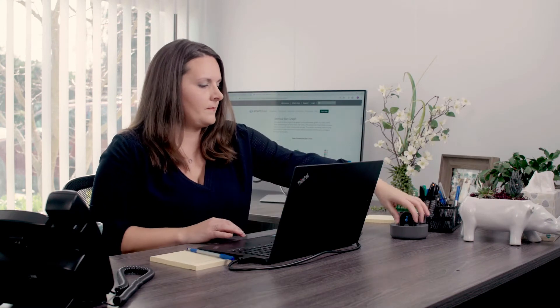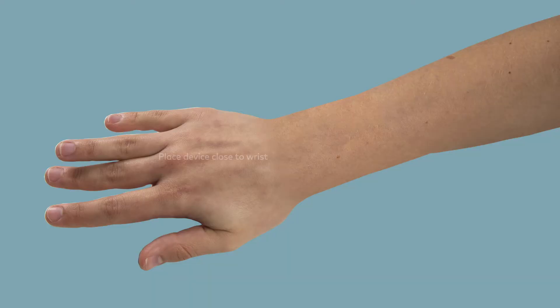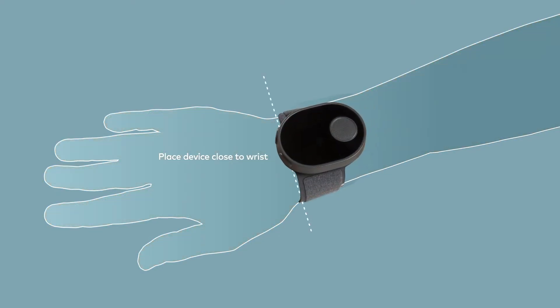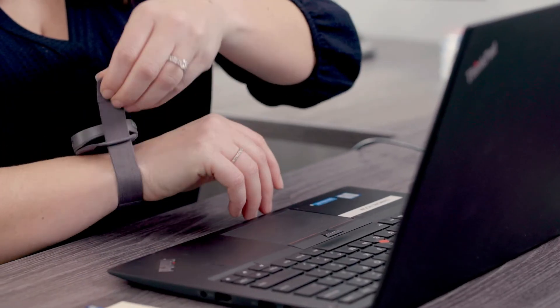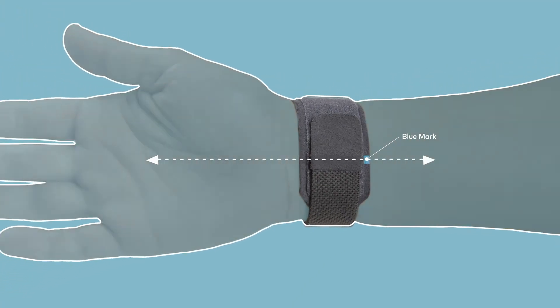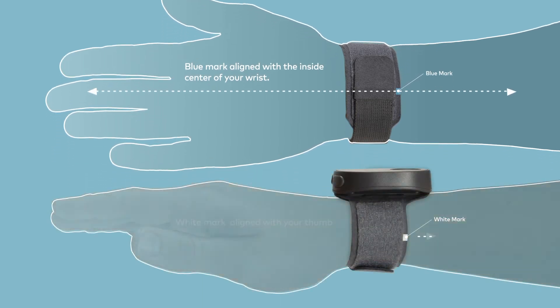Once your wrist is wet, slide the band onto your wrist with the main button facing towards your elbow. It's important that the device be positioned as close to your wrist as possible without covering it. This will enable you to move your hand freely during your therapy session. Next, tighten the Velcro strap. Be sure that the blue mark on the strap is aligned with the center of your wrist, like this.